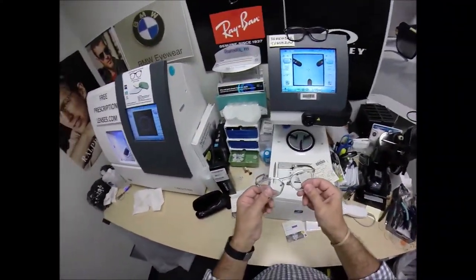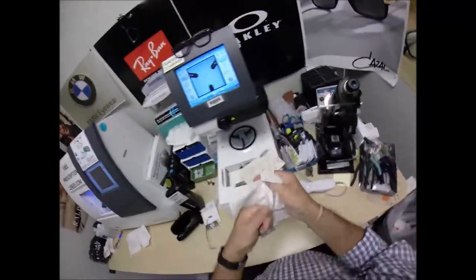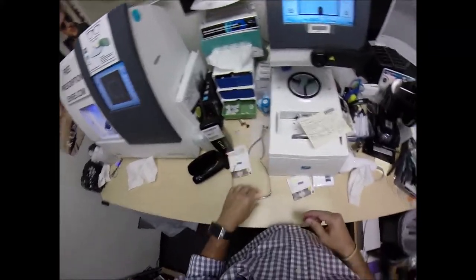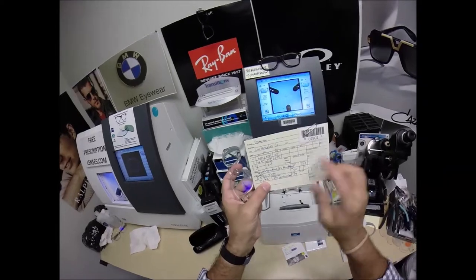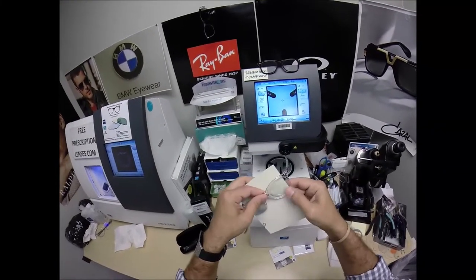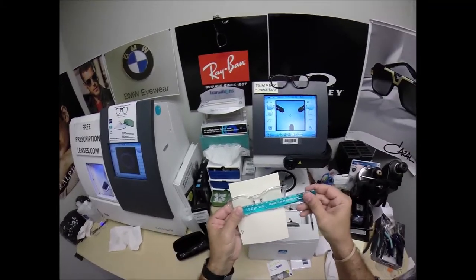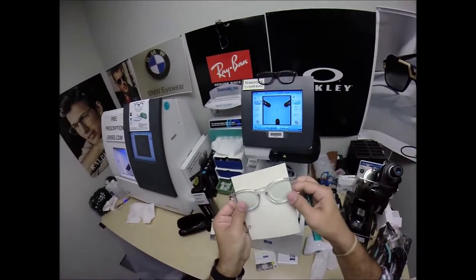The last steps of, look at that, I got ink on me. Inky, inky, inky. Okay. Being caught black thumb, that's better than being caught red-handed. So, your PD 31 plus 32 is 63, optical center height of 24. Turn the card around, place the PD stick against my thumb on your right lens. When we hold it up to the left lens, we're getting 63 millimeters, so that is cut perfectly.